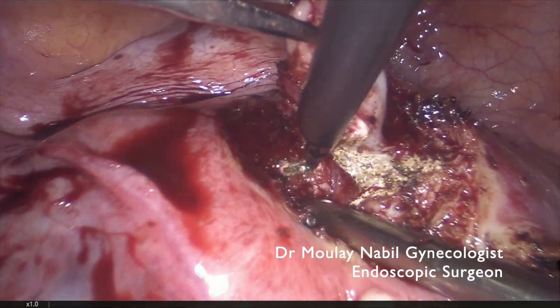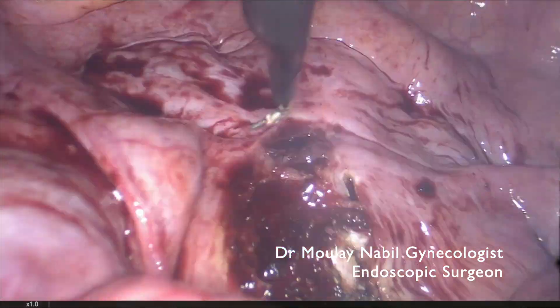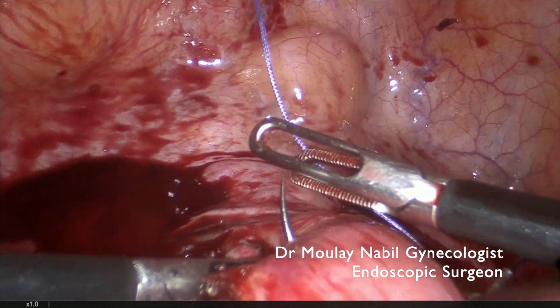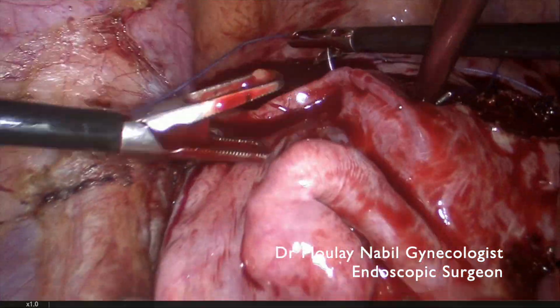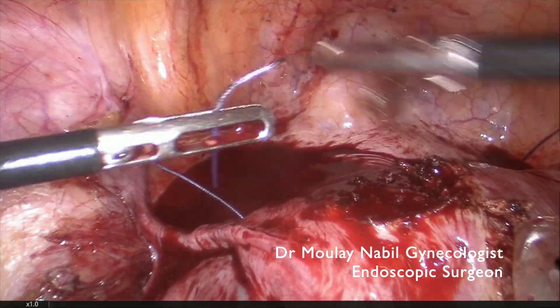We know that there is another myoma just below the previous one, and this myoma is removed. We don't lose time on electrical hemostasis even when there is some small bleeding. We ensure hemostasis by stitches instead.